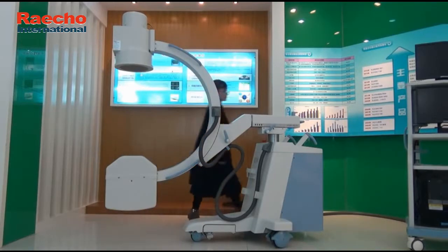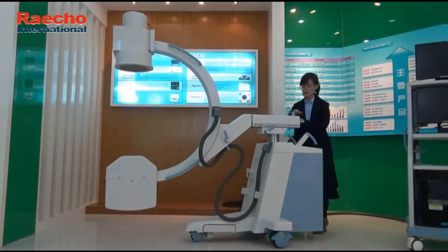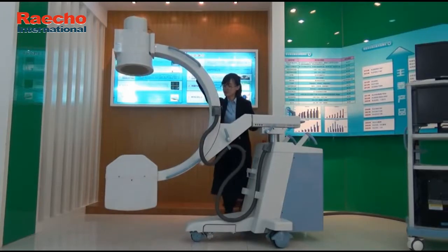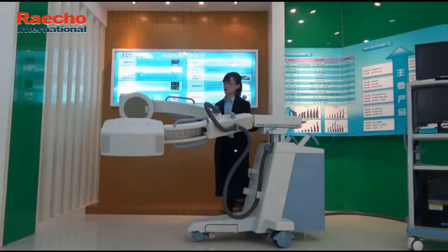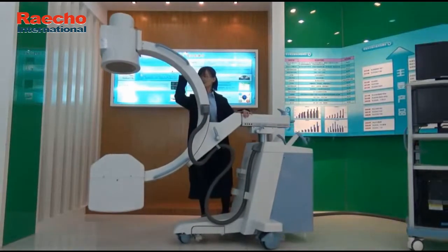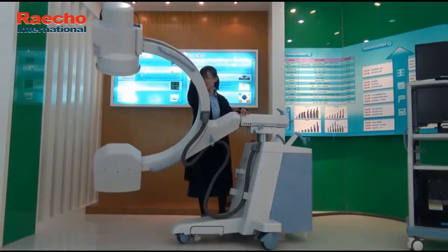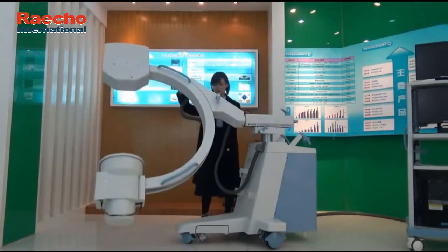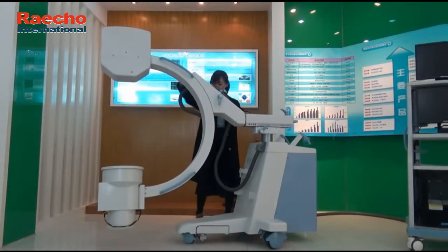Let's release the handle behind the frame. The machine can then be rotated along the horizontal axis. The range is plus or minus 118 degrees.